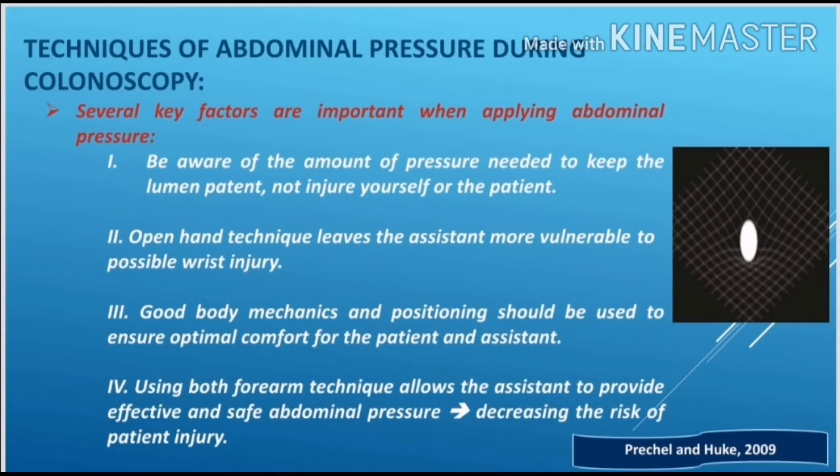First one, be aware of the amount of pressure needed to keep the lumen patent and not to injure yourself or the patient. Second factor, the open hand technique leaves the assistant more vulnerable to possible wrist injury.